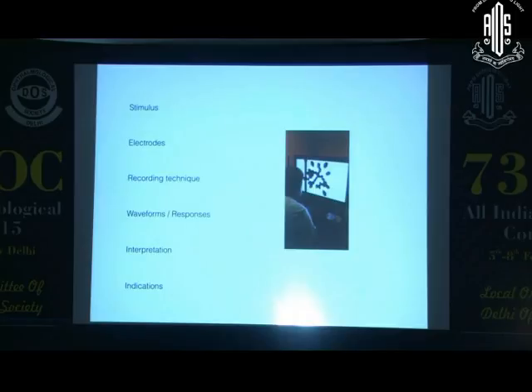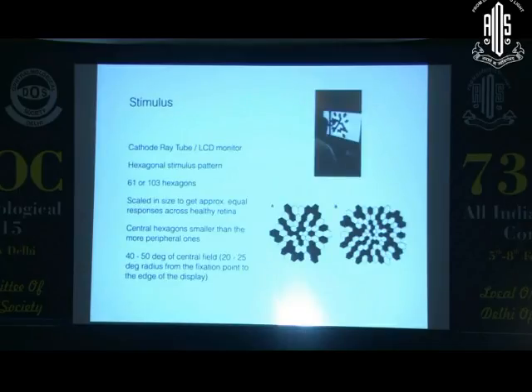What we are going to look at is how we essentially do this test. What are the stimulus and the electrode? You need to have background knowledge about these things to interpret the test. Then recording techniques, how the printout comes, what the different waveforms are that you see, interpretation, a brief word on that, and indications for doing this test.